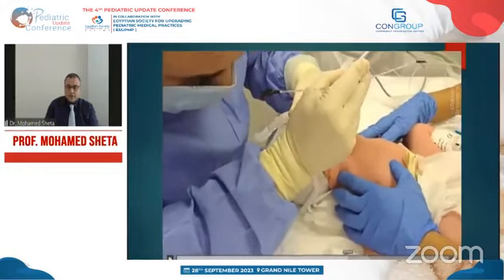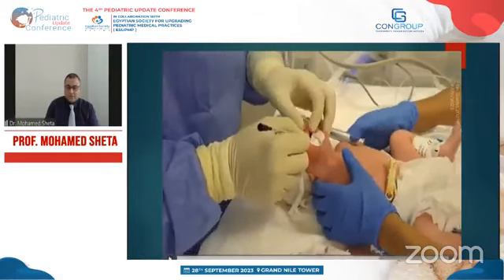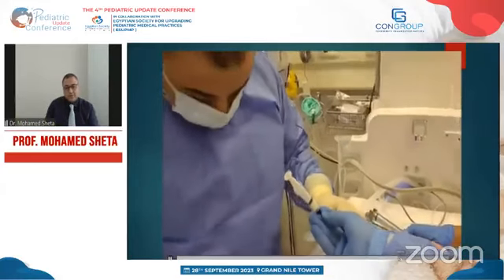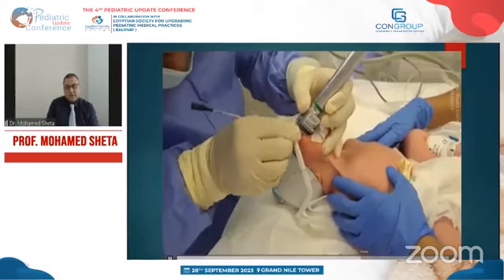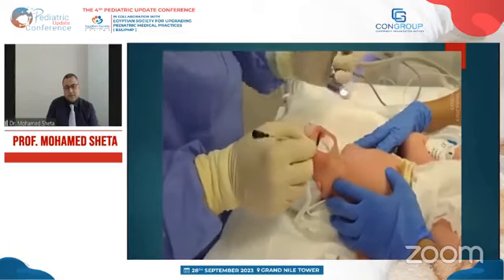I can show you the view with insertion, but it's not easy for the photographer to. Now I inserted the tube inside the larynx. Okay. Well, the tube is already inside.